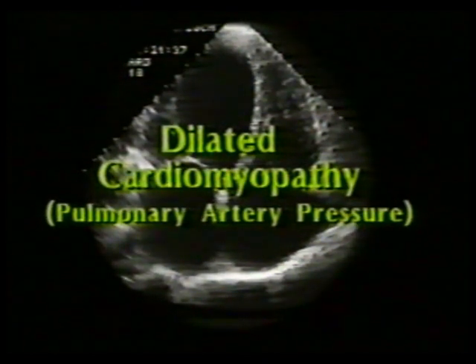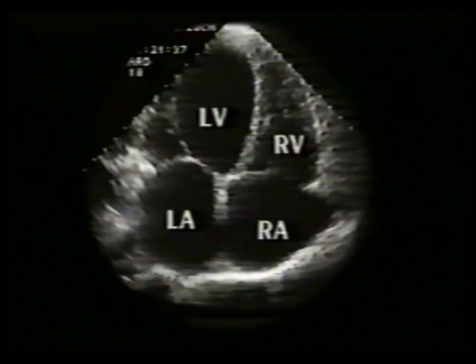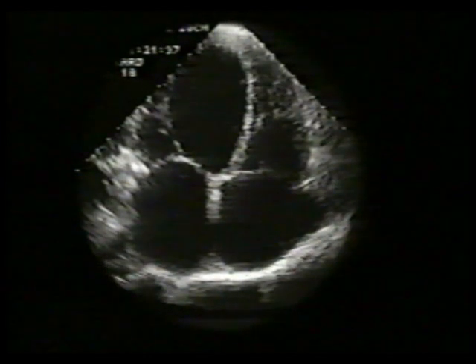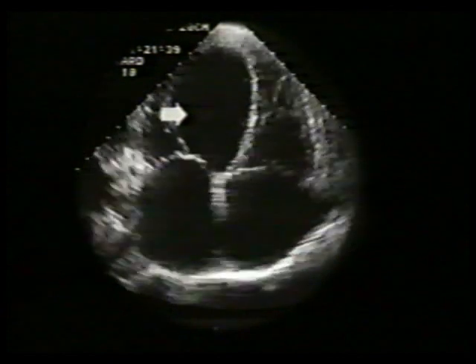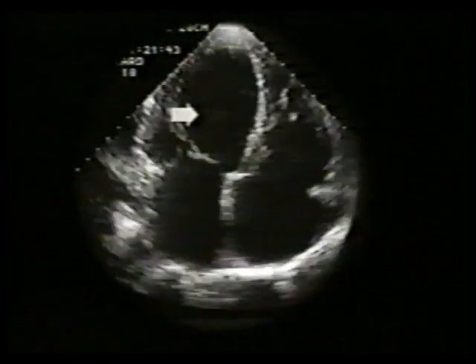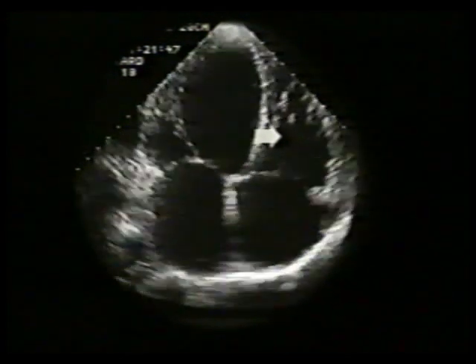Not only is the color flow analysis of tricuspid regurgitation useful for patients with dilated cardiomyopathy, but continuous wave Doppler determination of the TR velocity is also important. This 69-year-old male with dilated cardiomyopathy demonstrates enlargement of all four chambers. His left ventricular ejection fraction is severely reduced at 13%. And his right ventricular function appears moderately reduced.